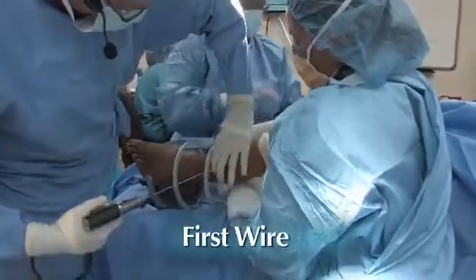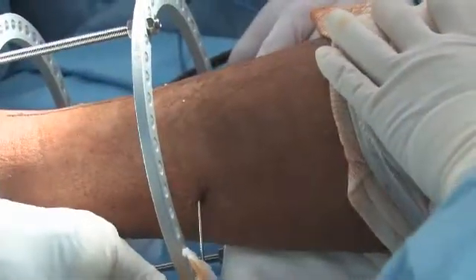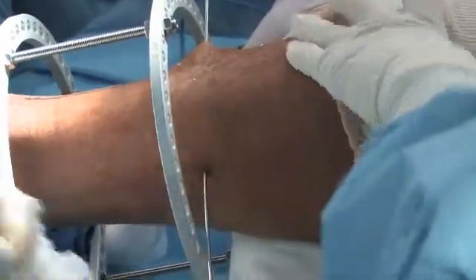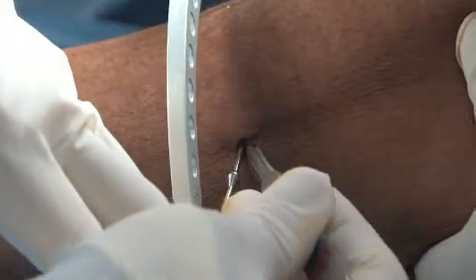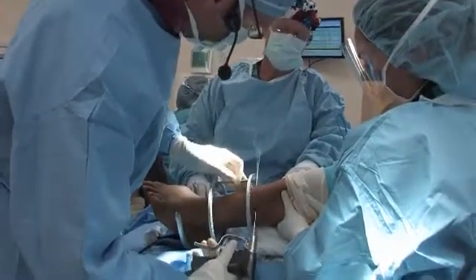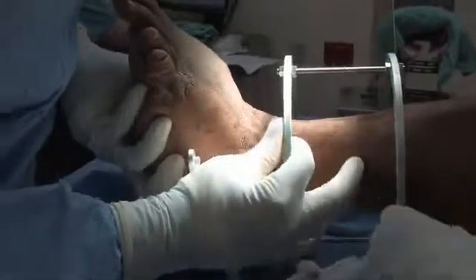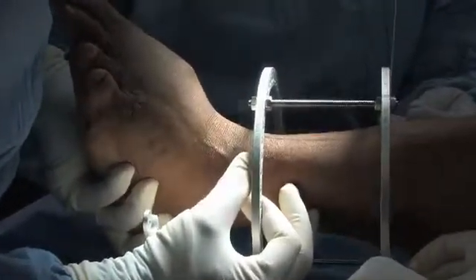We're going to pass the first wire from lateral to medial in the proximal ring. Yeah, 15 blade. So we want to get this olive right up next to the fibula. Need a wire fixation bolt. So I'm going to hold the foot at a 90 degree, see where I've got my frame. My assistant's going to put a wire fixation bolt. And those are finger tight.